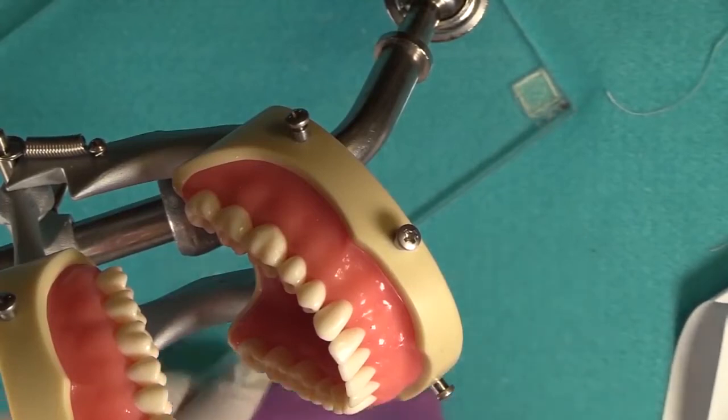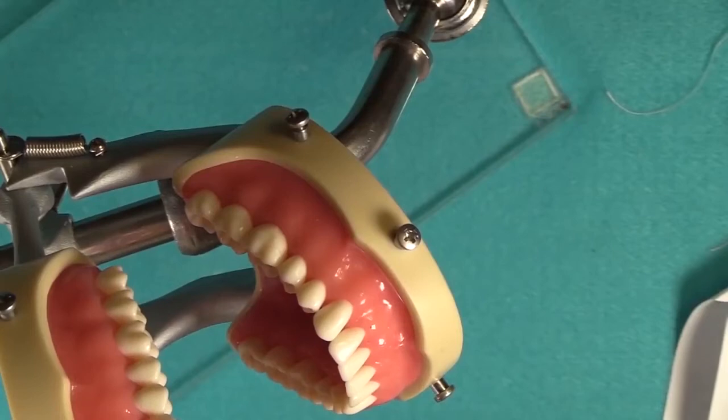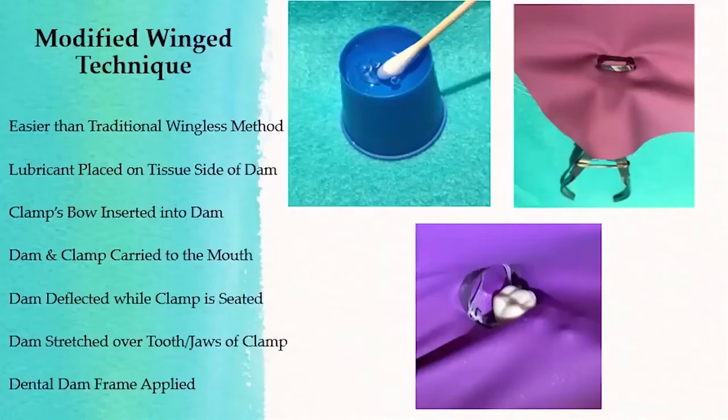I've seen situations where people will remove the frame and then try to engage the clamp, but by that time the dental dam falls forward and you can't see what you're doing. So just try to keep it as a unit when you remove it. All right, now the next thing that we're going to talk about is using the wingless clamp.